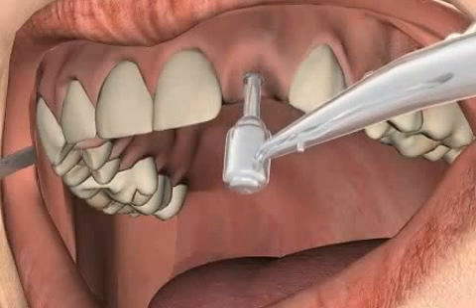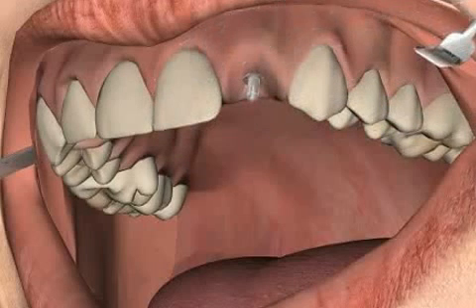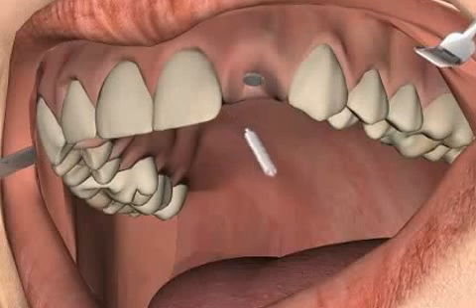Now the actual implant is inserted. You can see that the insertion rod is attached at the gums and thus stands out from the gums. The insertion rod is removed, and only the implant remains in the bone.